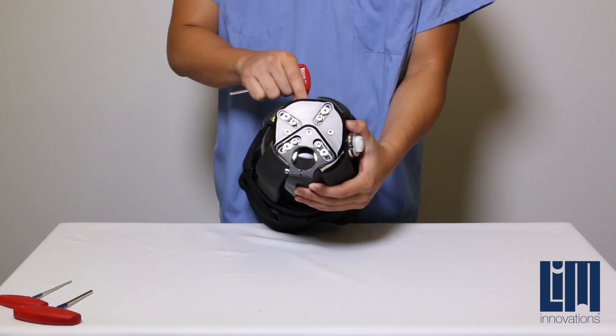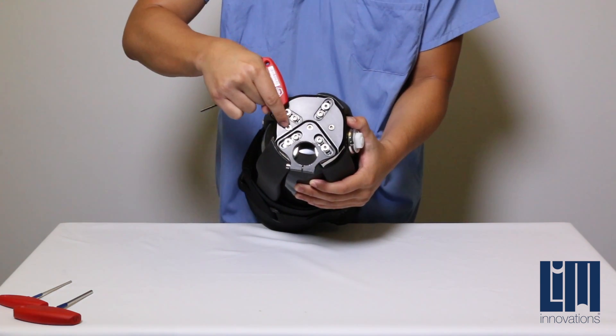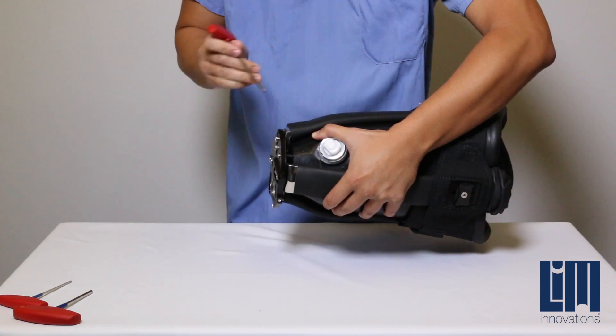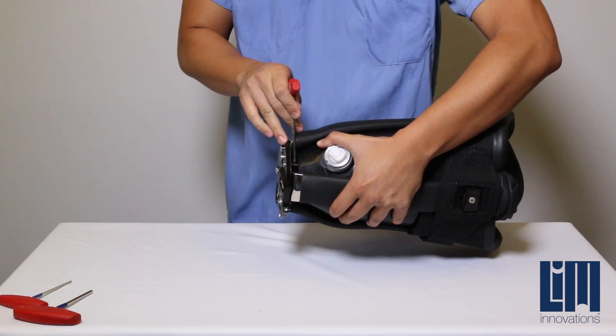Identify the three screws located at the bottom of the base plate, as well as the spacers located between the fill cup and the base plate. This can be viewed in between the struts.